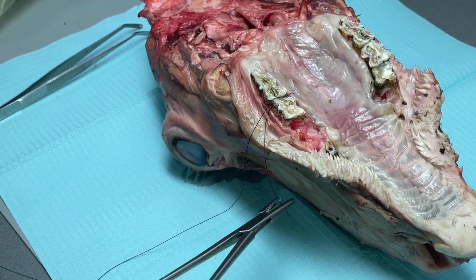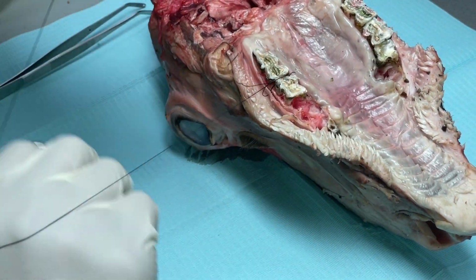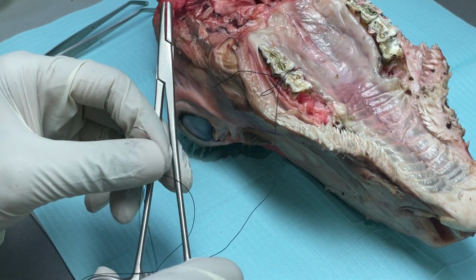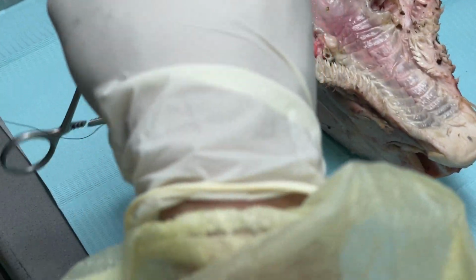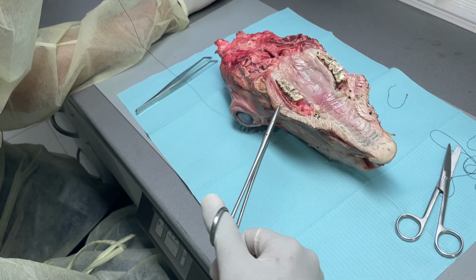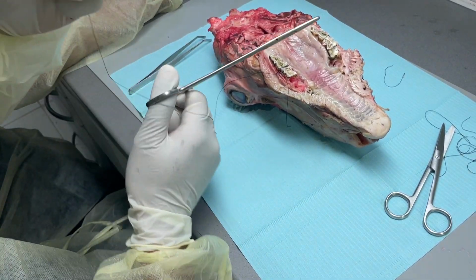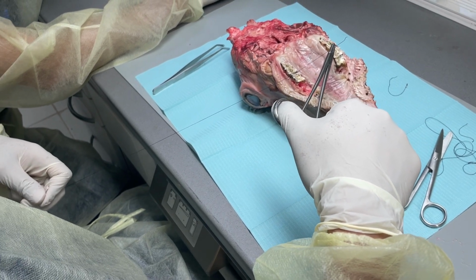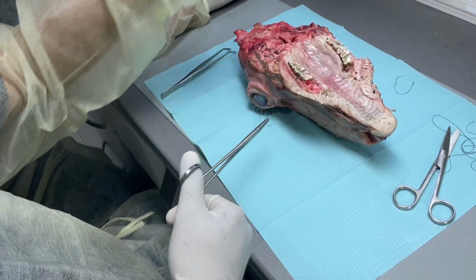One time, hold it, close it. One anti-clockwise, hold it. Sorry, sometimes it gets tangled. No problem. So one clockwise I did, and I will tie it. One anti-clockwise, and I will tie it. So that becomes the square knot. Clear? One clockwise, tie. One anti-clockwise, tie.